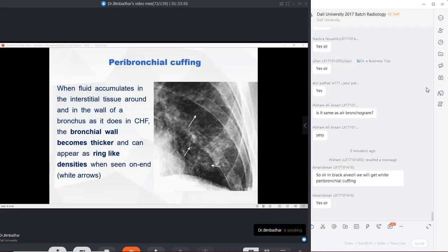So the recovery of congestive heart failure is exactly opposite compared to the progression of congestive heart failure. Did you understand it? The fluid inside the lungs has to be removed first. Then the interstitium will eventually get better by itself. So the therapeutic value of this finding is high. Did you get it? We are trying to analyze the progression of the condition.